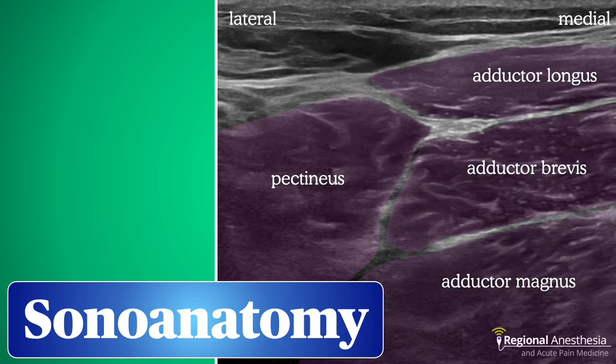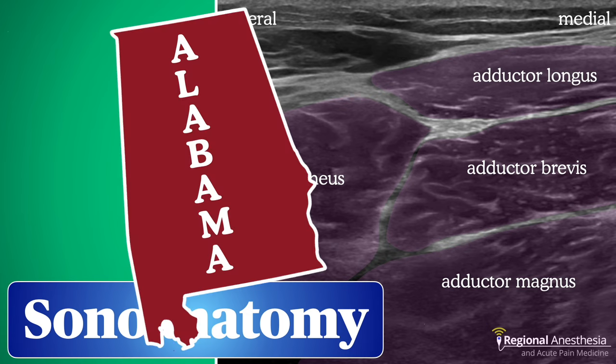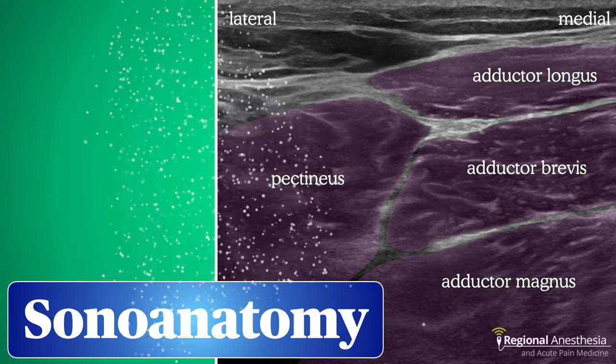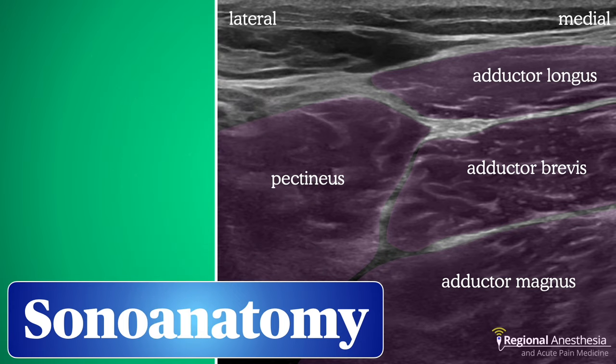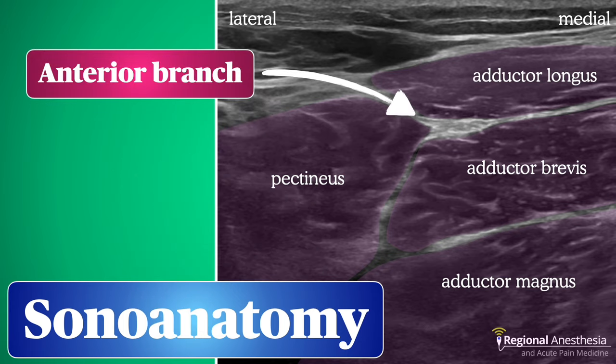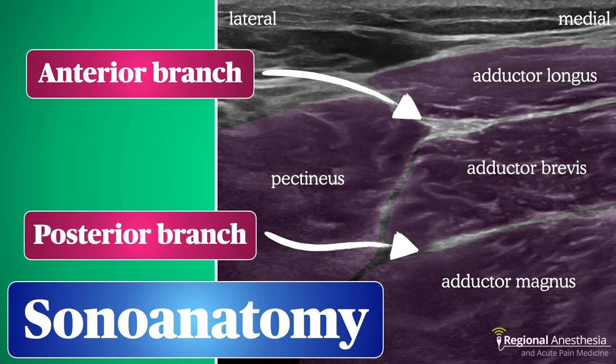A memory aid for remembering the order of the adductor muscles is 'Alabama' — adductor longus, adductor brevis, adductor magnus. Once we've identified the muscles, it's easy to find the nerves. The anterior branch is usually found at the confluence of longus, brevis, and pectineus, and should appear as a hyperechoic structure within that fascial plane. The posterior branch is typically located in the fascial plane between brevis and magnus.